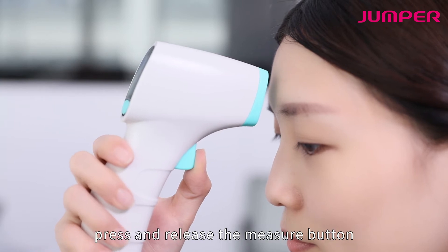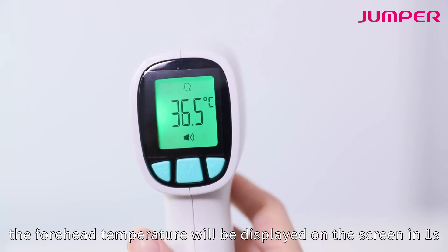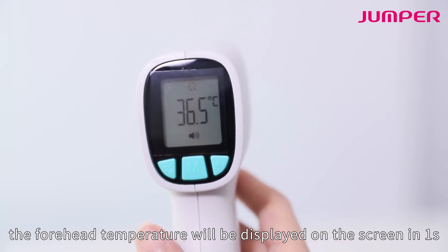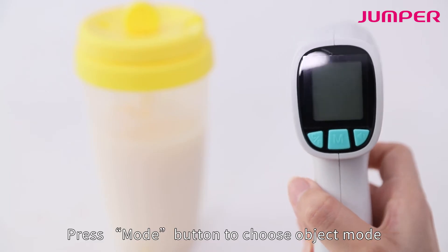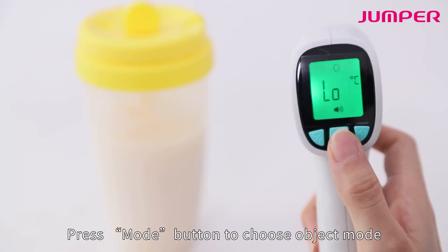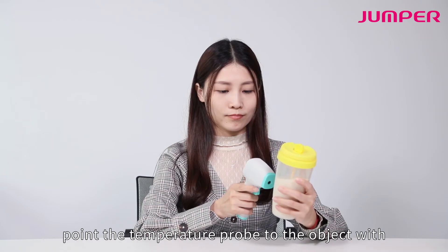Press and release the measure button. The forehead temperature will be displayed on the screen in one second. To measure object temperature, press the mode button to choose object mode, then point the temperature probe at the object with a distance of 1 to 3 centimeters.